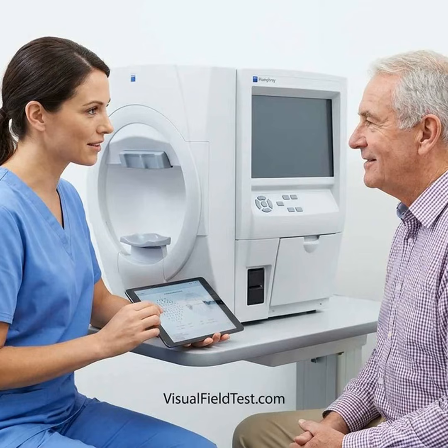Practice and home testing can reduce unfamiliarity and anxiety, but home systems currently show variable reliability and should not automatically replace supervised clinical perimetry. The most effective model is usually clinic-based coaching, plus optional home review and reminders, with the final interpretation made by an eye care professional.